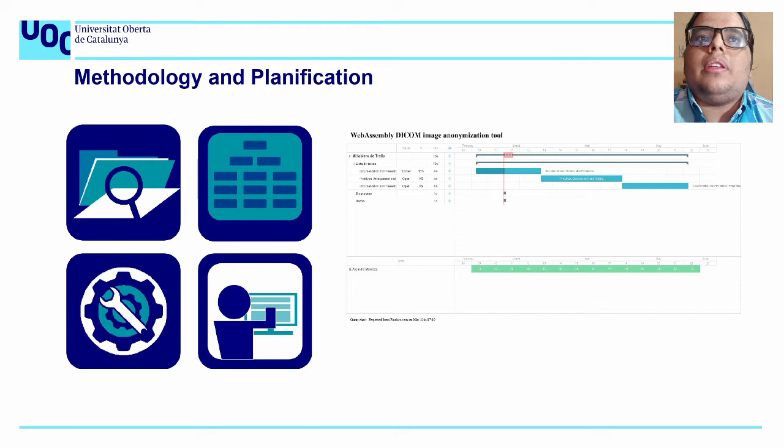Also, this project supports the Sustainable Development Goal number 10, that is reduce inequality within and among countries. By using web-based technologies, this tool reduces the need for physical resources and infrastructure required for medical data anonymization. This can help health professionals working with tight budgets with the process of medical data anonymization to ensure that the privacy of the patient is respected when data sets are created.